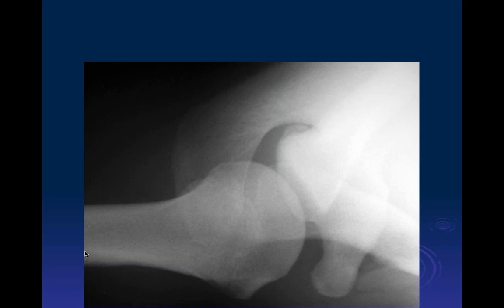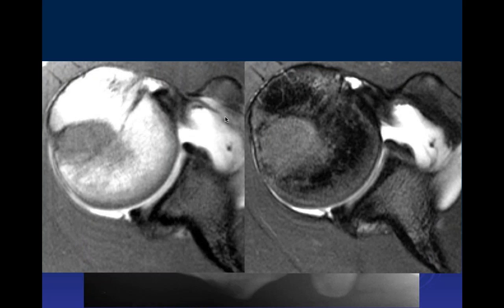Yeah, we have a radiograph with the axillary view of the right shoulder. And on the, I guess, this anterior aspect of the glenoid, there's this curvilinear density. Posterior aspect? Oh, that's right, because the coracoid's anterior. That's right. So the posterior aspect of the glenoid, there's this curvilinear density. Okay, so then axial views, T1 and PD fat-sat in the patient who's had an arthrogram, and there's thickening along the posterior glenoid, which could correlate with this focal area of calcification.